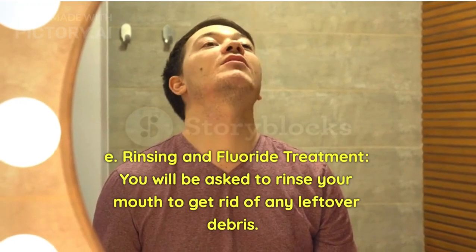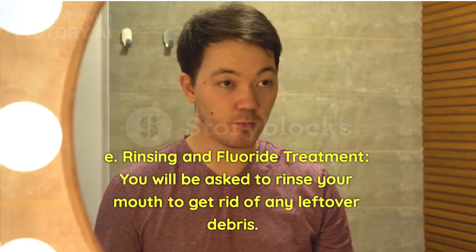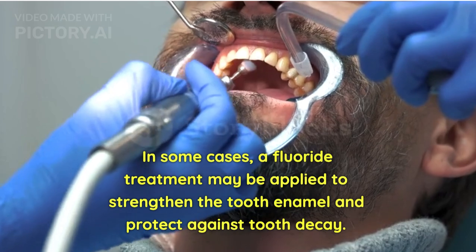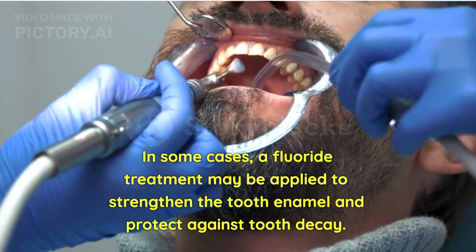Rinsing and fluoride treatment: You will be asked to rinse your mouth to get rid of any leftover debris. In some cases, a fluoride treatment may be applied to strengthen the tooth enamel and protect against tooth decay.